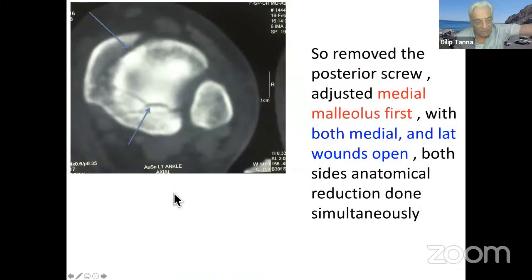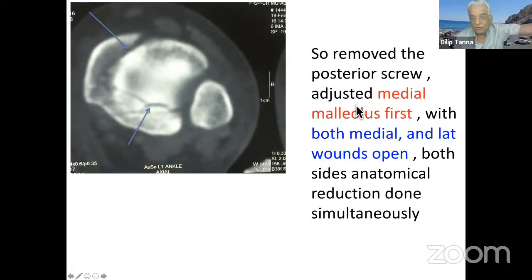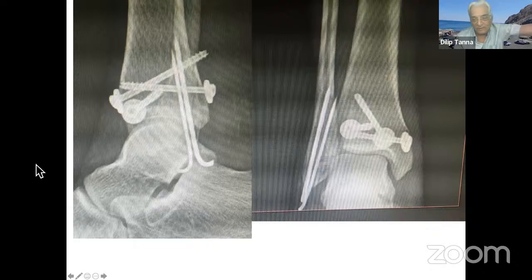I couldn't reduce the medial malleolus. And then I saw here, this is one continuous piece. This is what I realized when I couldn't reduce it after the posterior malleolus was reduced, which to me I thought was perfectly reduced. So I removed the posterior screw and adjusted the medial malleolus first. With both medial and lateral wounds open, anatomical reduction of both sides was done simultaneously. Once it was done simultaneously, then nothing more was needed.